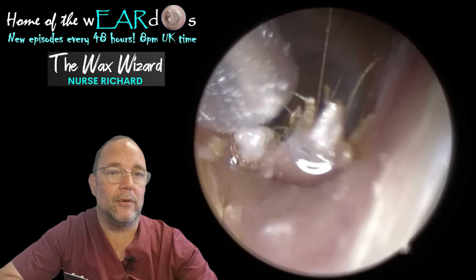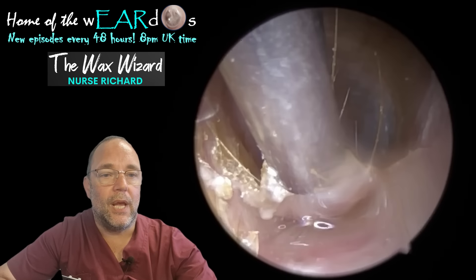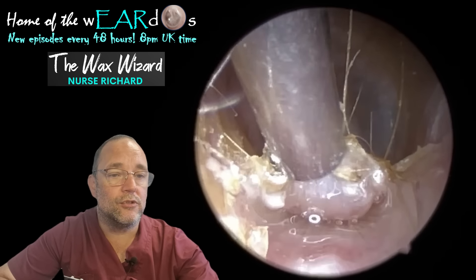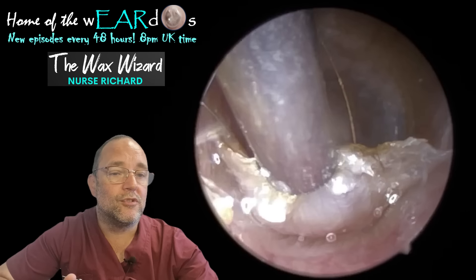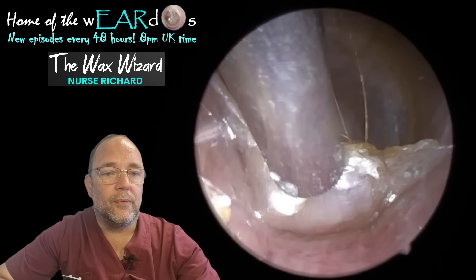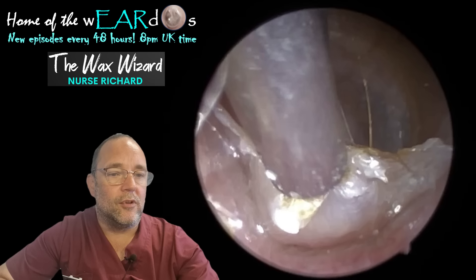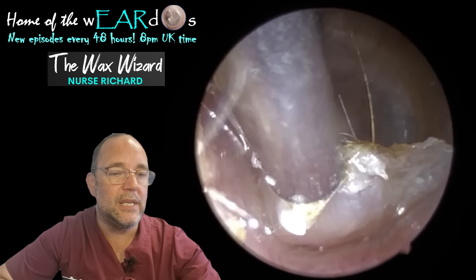As you can see, it's gone all blurry — the old dream sequence again. Anyway, itching — the medical term for itching, if you're interested, is pruritus. If something is pruritic, it's itchy. Now you can see the difference the olive oil makes. When I lift it up, it kind of seeps down underneath and makes it a bit easier to peel away.